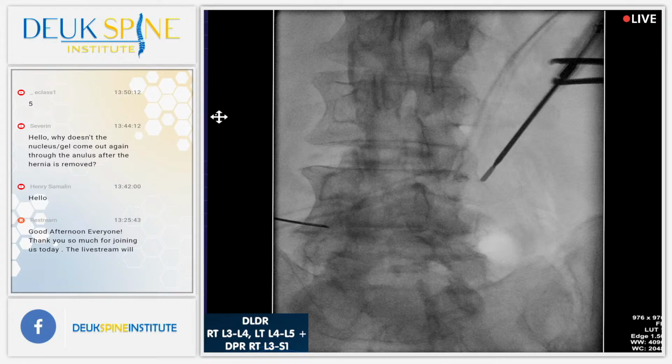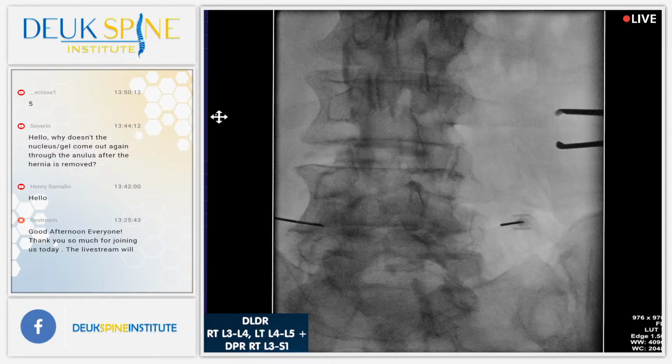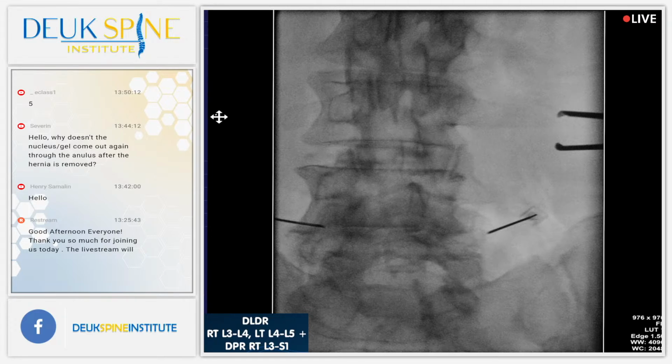Okay, and I'm making sure I'm getting that nerve, that pain nerve. I'm burning all around there. Okay? Because I don't want to have to come back and do this again. So you want to take your time and get it right. How's he doing? Good? Shot? All right. Now this next one is tough, but you can see it. I'm almost perfect where I am. Almost perfect. That's probably going to be it right there. Oh, perfect. You guys see that? No, one more. I got this, one more, and then I don't think I can do anything on that other side. The disc is fused.